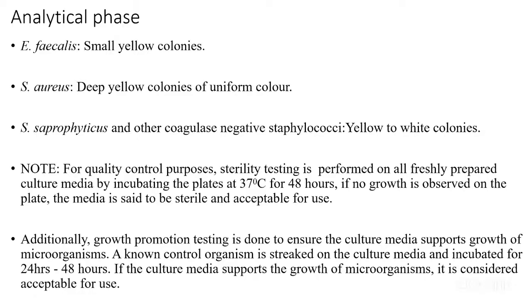For growth promotion, to check if the media will support the organisms that you have, you will do growth promotion testing. You inoculate known organisms on the media, then incubate the plates for 24 to 48 hours. If the media supports the growth of the known organisms, it is considered acceptable for use, and you'll be comfortable enough to do your cultures knowing that your media are fit for use.